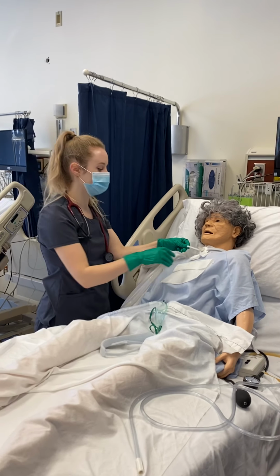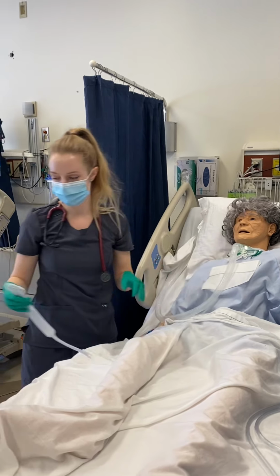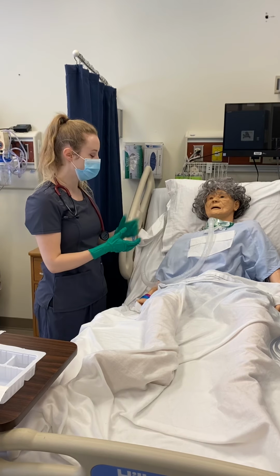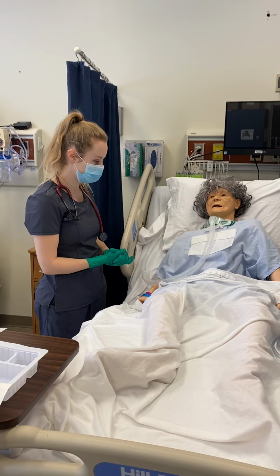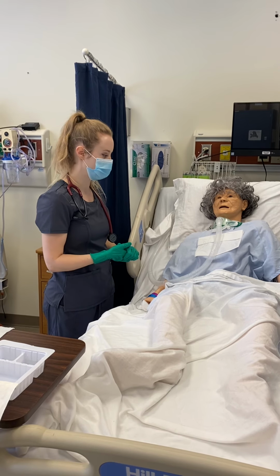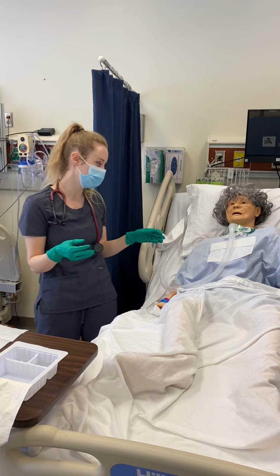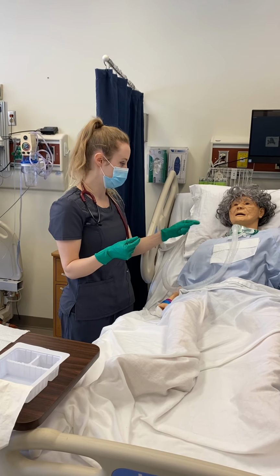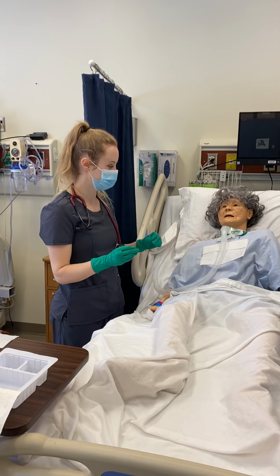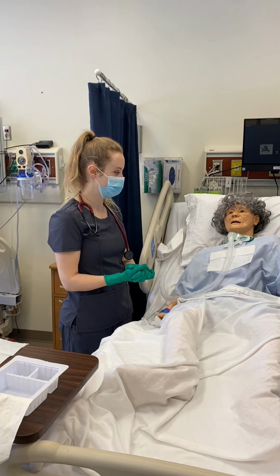And I want to ensure that my patient is doing okay, putting oxygen back on, but turning it down to the pre-oxygenation level. I want to check on my patient, how they are doing, how they tolerated the procedure, and then I want to document how the tracheostomy site looked, whether there was any redness, breakdown, secretions when I cleaned, what the bandage looked like, was there bleeding, and I want to ensure that I document all of that, how my patient oxygenated and at rest, and that is it.